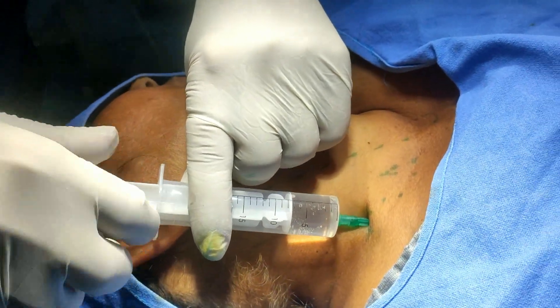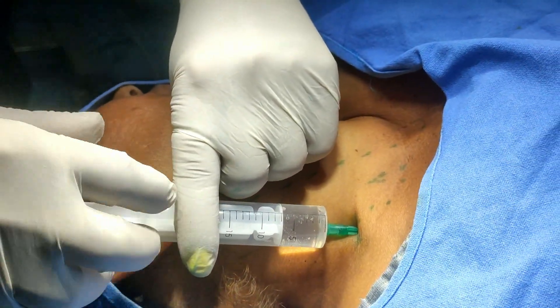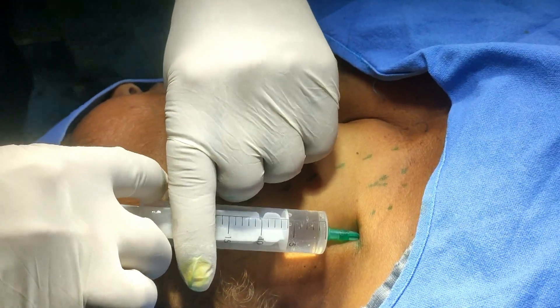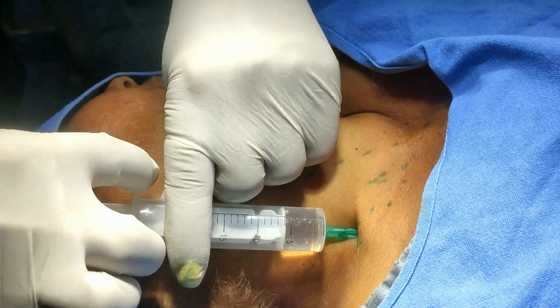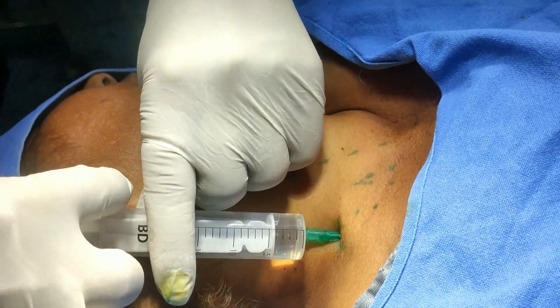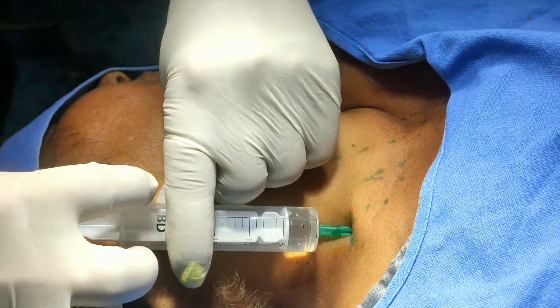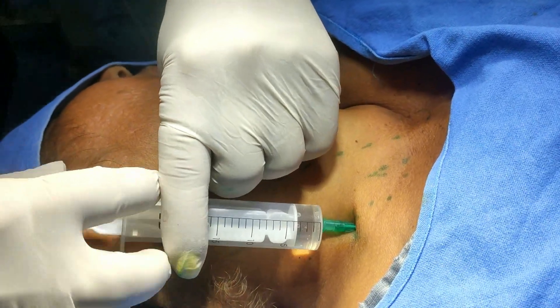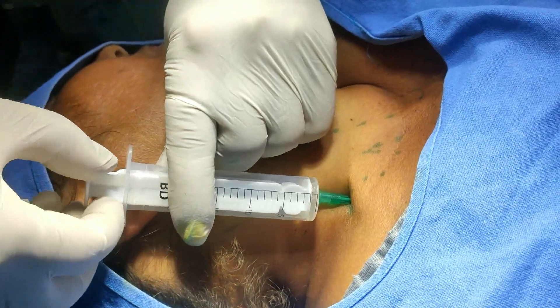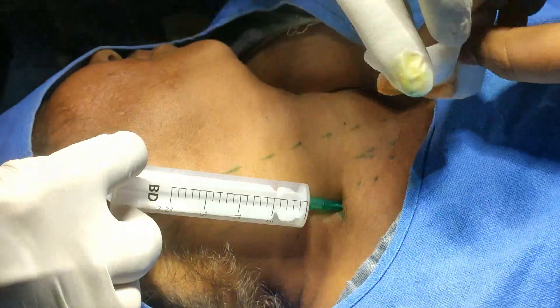So this is my own technique. This is basically a supra-omohyoid interscalene triangle brachial plexus block. This is most of the time successful — hardly any failure. And I am not touching any of the nerves, so there is no nerve stimulation. I am not purposefully eliciting any paresthesia. So the block is complete.